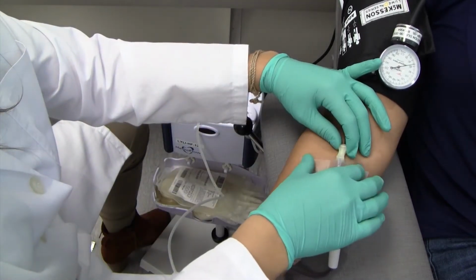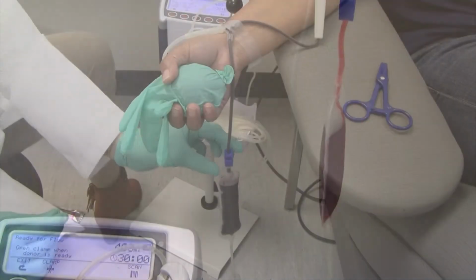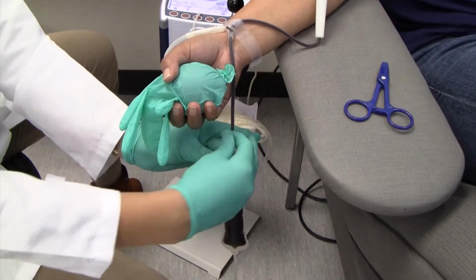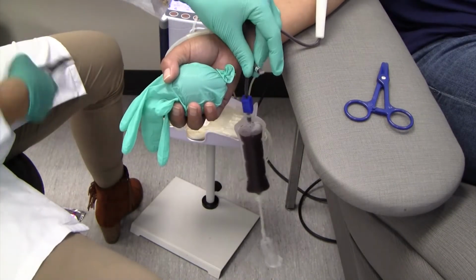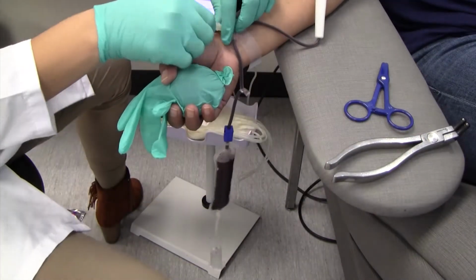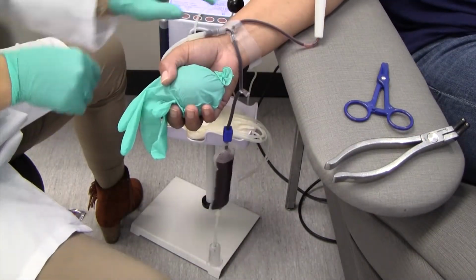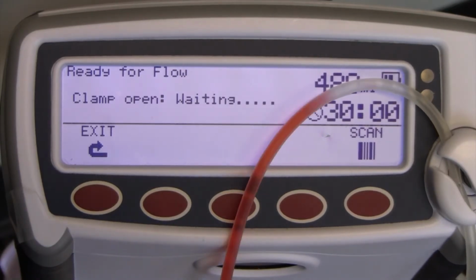Fill the diversion pouch. Close the pinch clamp between the diversion pouch and Y. Seal tubing between the diversion pouch and Y. Break the snap open closure. Press clamp to open the clamp on the HemoFlow and capture start time.